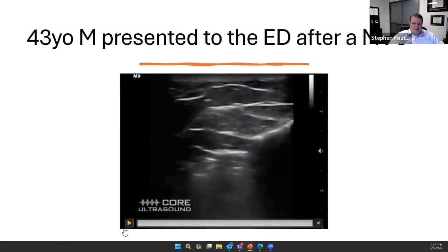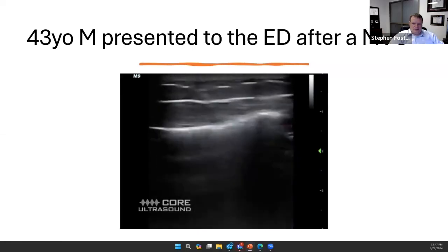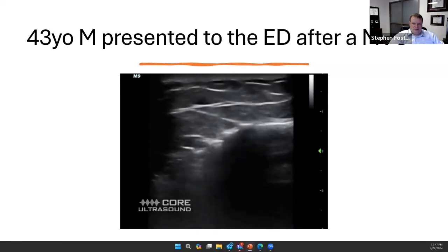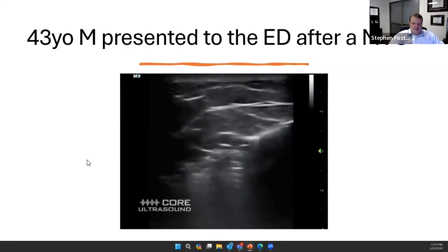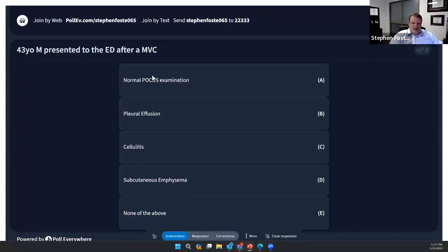Play it one more time. All right. So based on that ultrasound, what is your interpretation of the results? Is it normal? Was there a pleural effusion present?